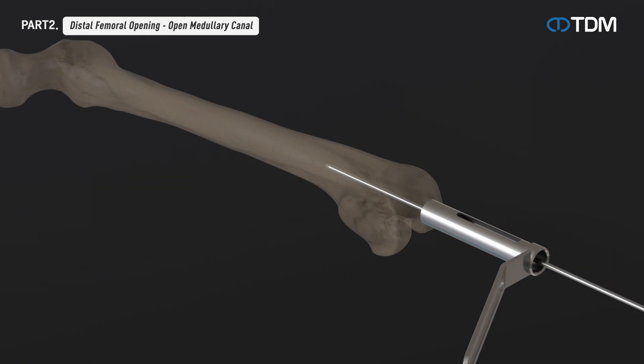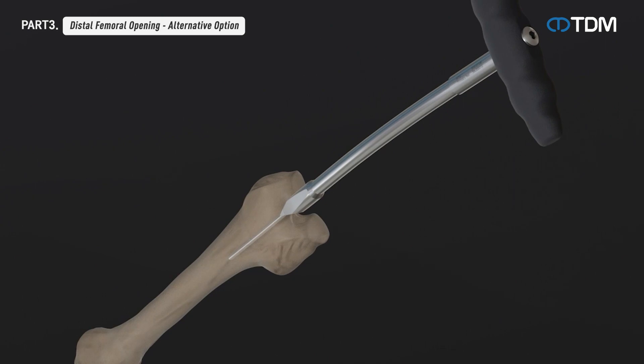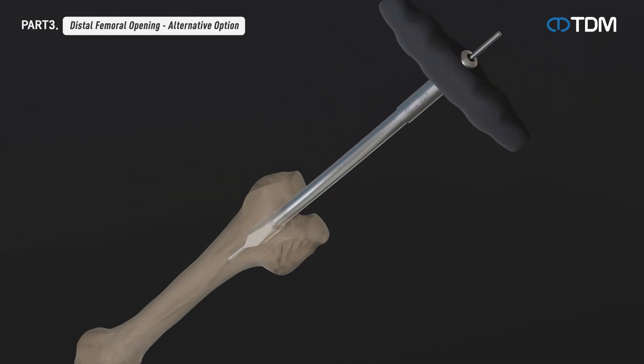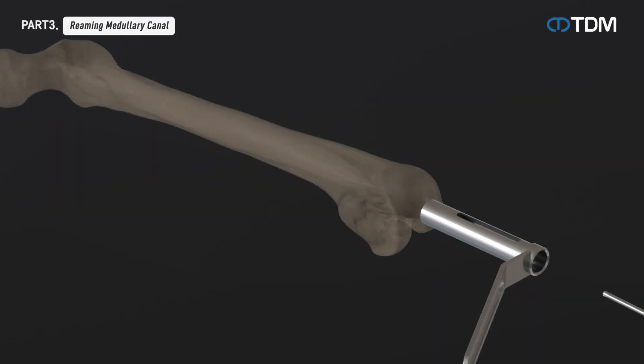Alternatively, opening the medullary canal may be performed using a primary awl.